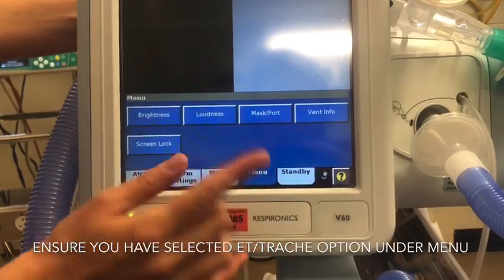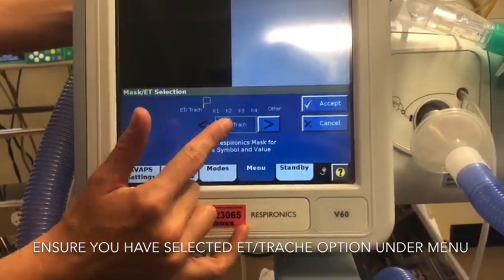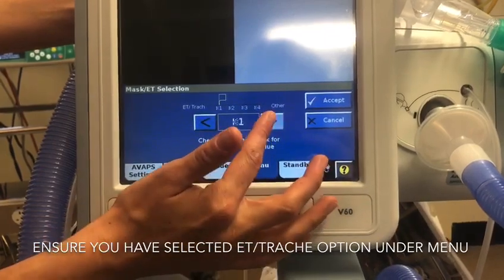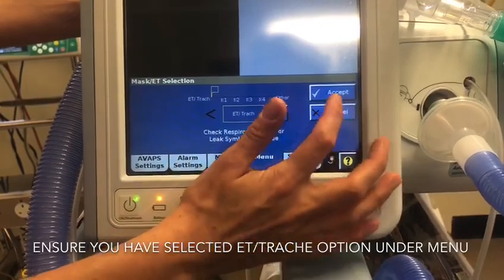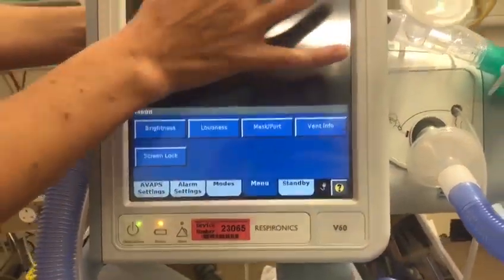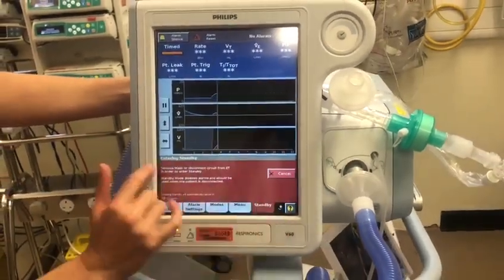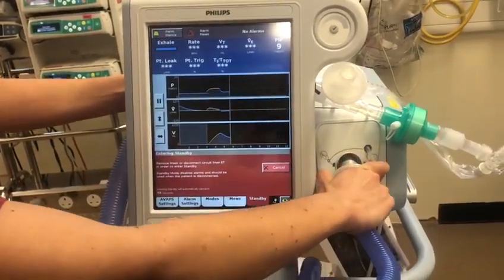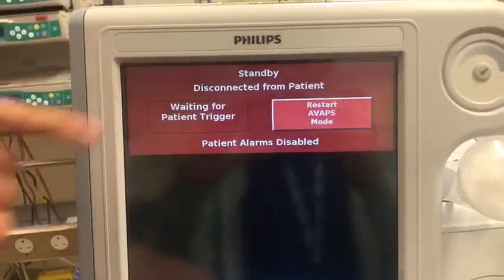In your menu, you need to make sure that on your mask port, you're on ET/trachea. Any other settings are for your BiPAP modes. So check ET, accept. To restart your ventilation, you press your start. And like I say, to turn to standby, press your standby and disconnect your patient. For your alarm, you have silence and reset at the top.